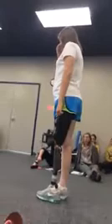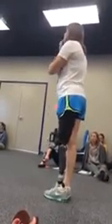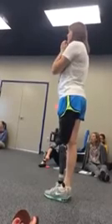All right. So what do you guys think? How's she doing on step width? When she's walking, it kind of seems like the faster she goes, the more it seems to go that way. When I think she starts thinking about it, having a bunch of people looking at her walking. It adducts in what way now? Adducts immediately. Her prosthetic one does? Yeah. Anyone else see that? I'm not questioning you. Yeah.